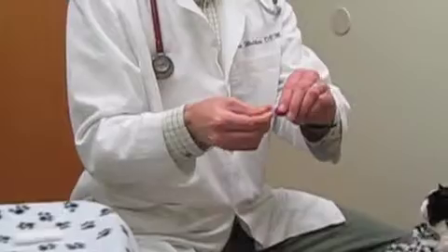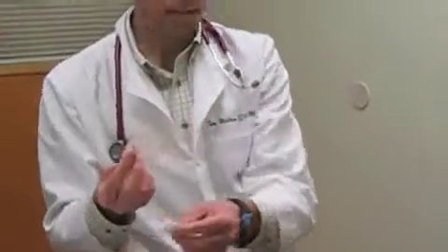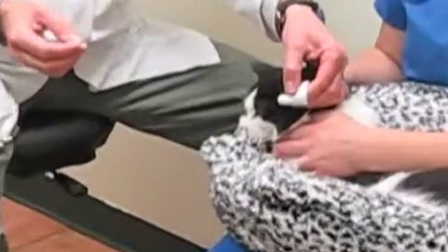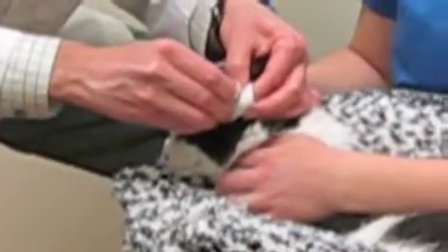We take our lancet, break off the tip, and you have your tiny needle. It's nice to take a little piece of gauze when you're doing this — that way you also know you can't go through the ear and poke yourself. I'm going to come on up to my patient, apply a little pressure on the ear margin, and just go ahead and give a little poke.